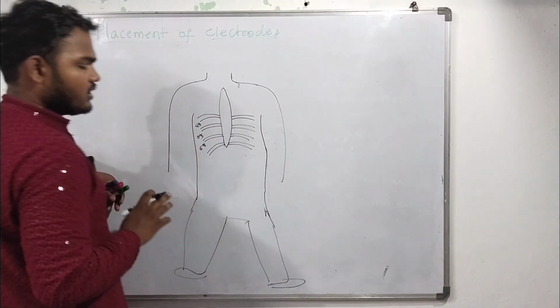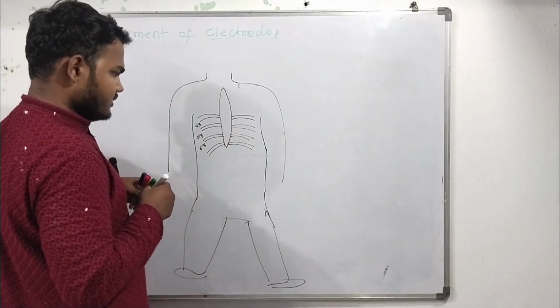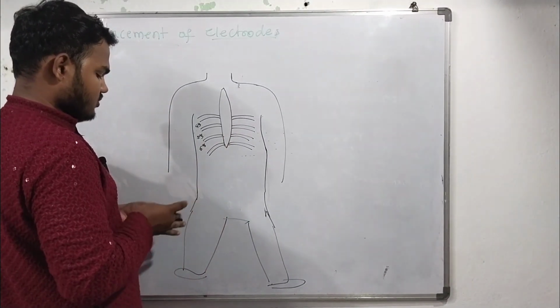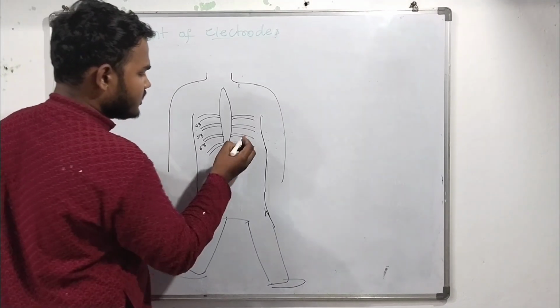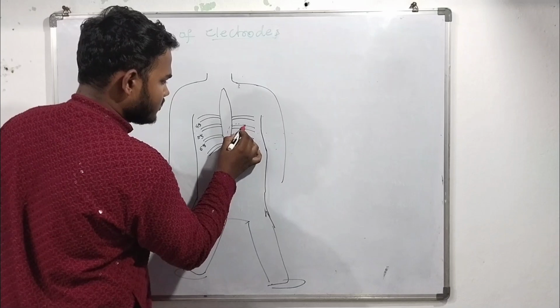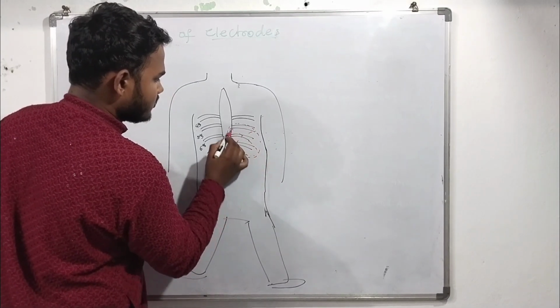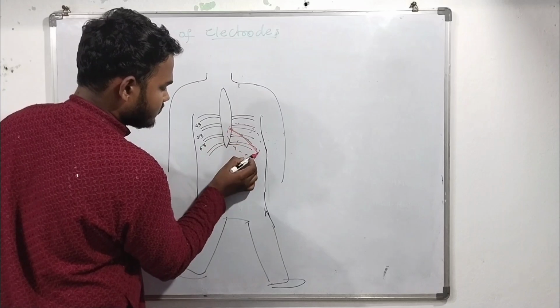This is the sternum. Now the heart is situated here, somewhat here. This is the heart.